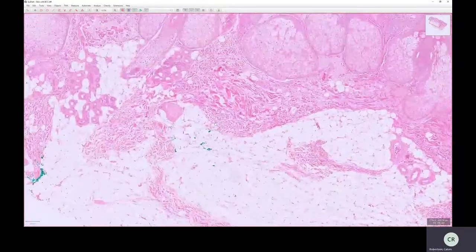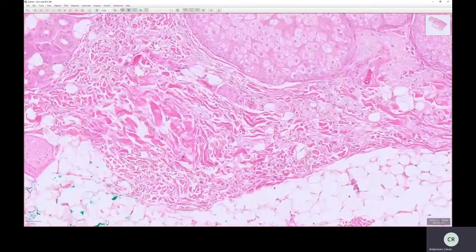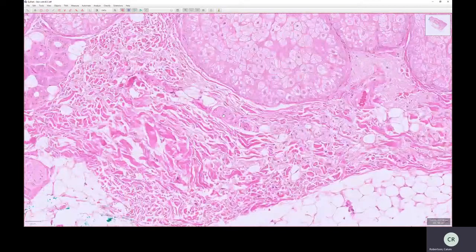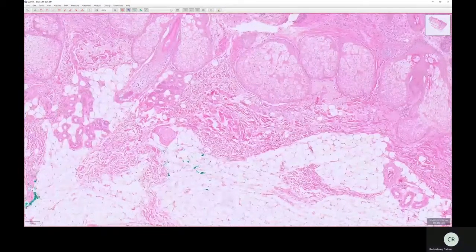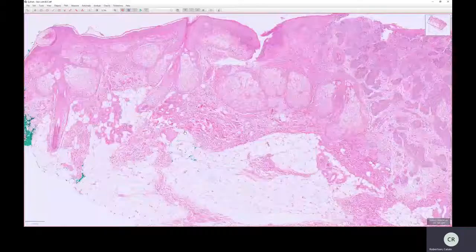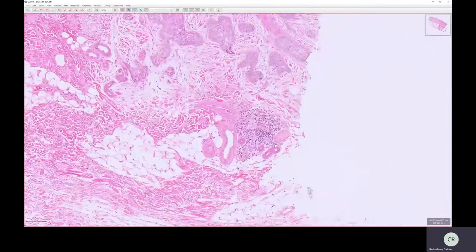other than to say that often you see nerves hanging about with their buddies, the vein and the artery. Here's probably an example of that. Here's a nerve and here's a vein, and that's maybe a wee arteriole. They hang about together often, and when you see one, you'll often see the other round about it. Vein, artery, and nerve running together.